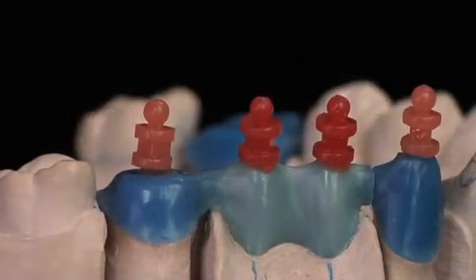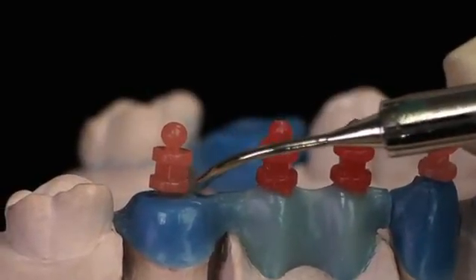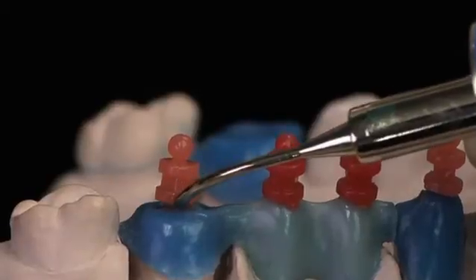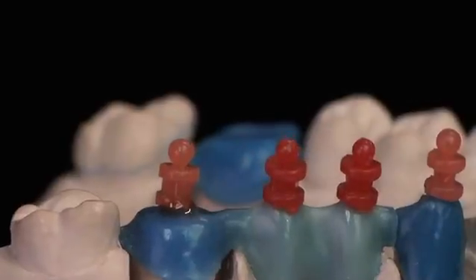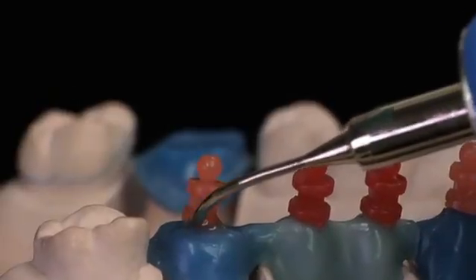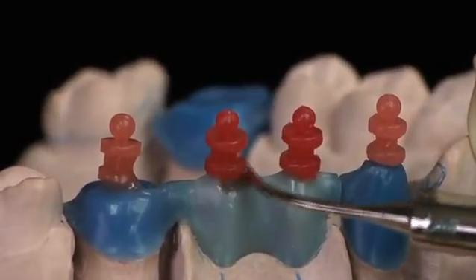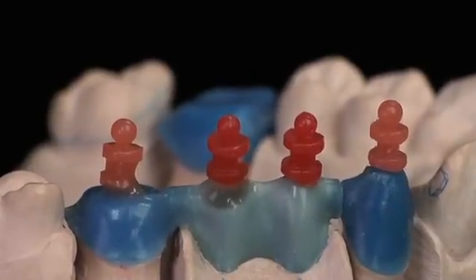Now I'm going to seal the quick sprues to the pattern. The quick sprue has a base on the top and the bottom to give you a little extra wax to allow you to seal the sprue to the pattern just by melting that little wheel. Make sure when you do this that you do not melt into the square area of the sprue. I'm going to continue down the line to do each facial surface of the quick sprue, and then I'll come back and do the linguals.